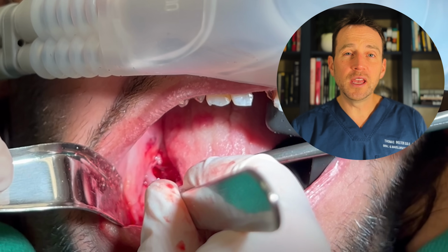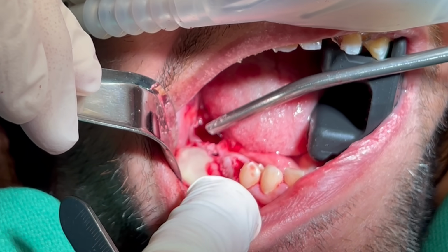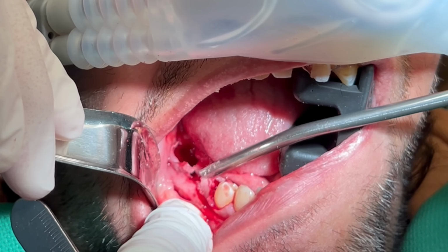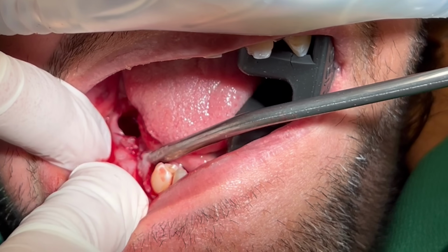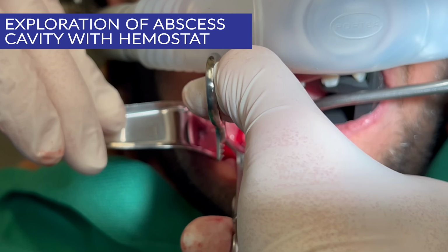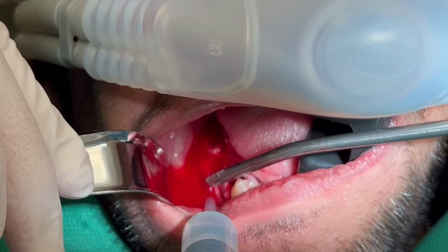I make a stab incision, and immediately we can see a large amount of purulence. There's a significant amount of purulence here, and I'm going to put digital pressure to drain as much as possible. Next, I explore with the hemostat. Finally, I rinse this area thoroughly to clean all of this infectious material out.